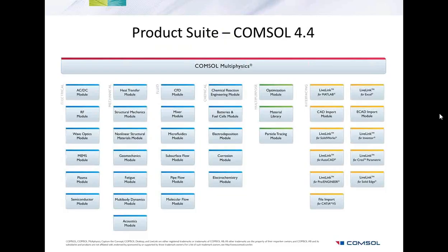Okay, our next question. How did you implement the elemental bone material properties from the patient CT scan in COMSOL? Okay, as I said earlier, the CT scans come in what they call Hounsfield units, which are literally coordinates with HU values. So they have an X, Y, Z value and a point with a grayscale value. And we literally imported those text files inside COMSOL.